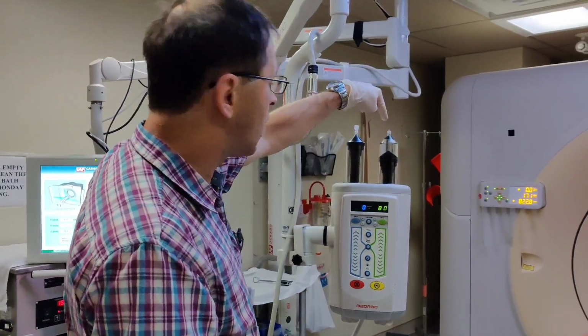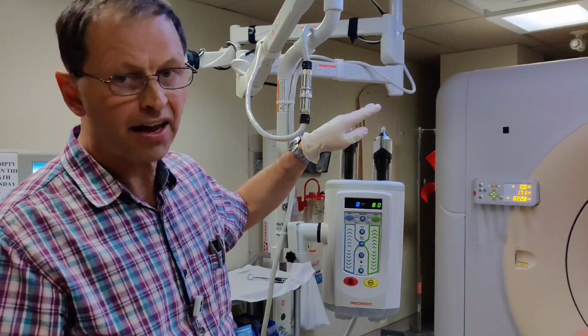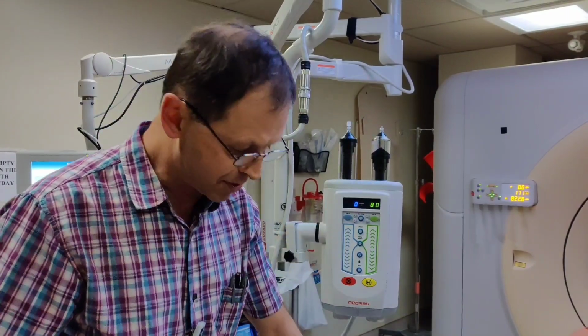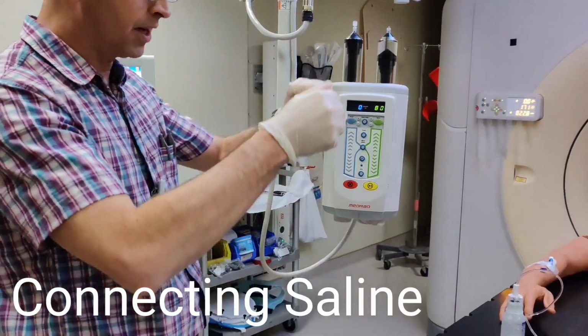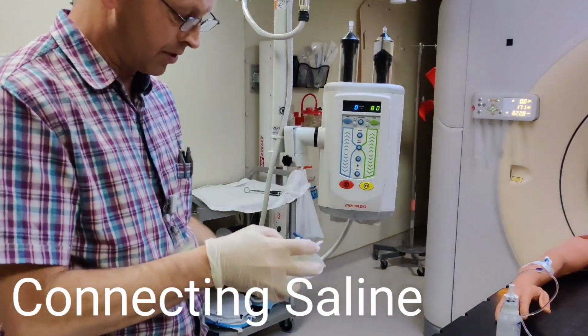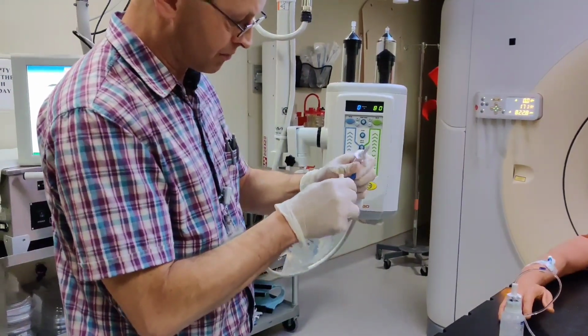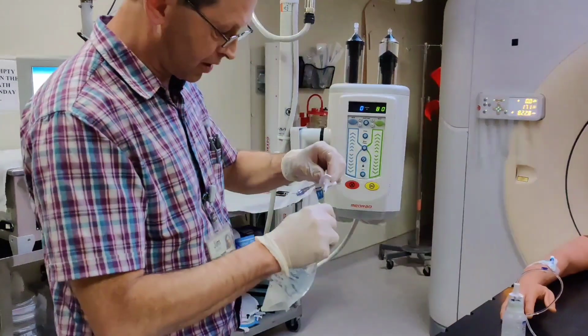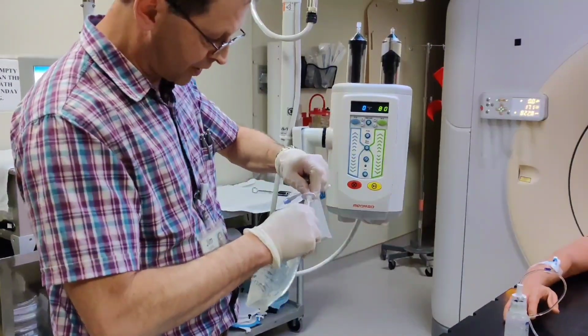Again, be cognizant of not contaminating that tip. You could replace the tab. If you think you've had any contact with that tip, take an alcohol swab and just clean it. So again, I'm going to remove the tip. I'm going to remove the connector from here. And I'm just going to gently, again, being careful not to contaminate.